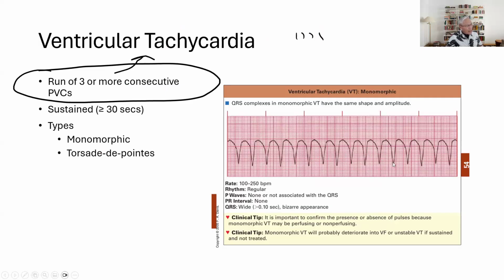Notice that in this ventricular tachycardia, they're all uniform, isn't it? The complexes are all going down, correct? This is what is called monomorphic, meaning to say mono means one, morphic means shape. So this is what's called a monomorphic ventricular tachycardia. Okay, supposing I have monomorphic ventricular tachycardia and my blood pressure is 60 and I'm telling you, nurse, what are you going to do? What is the appropriate treatment?